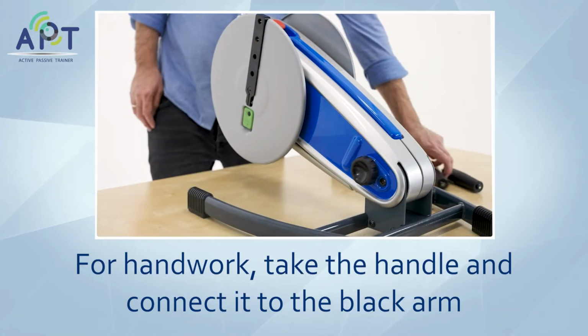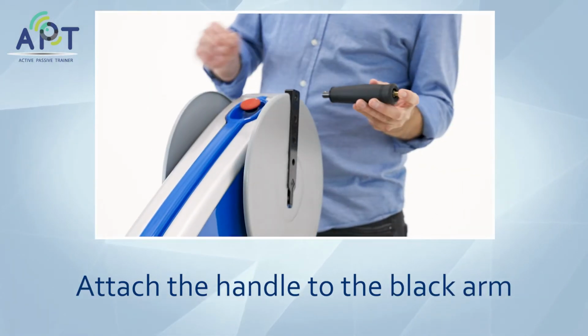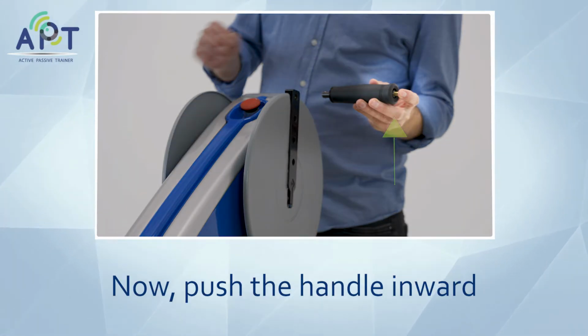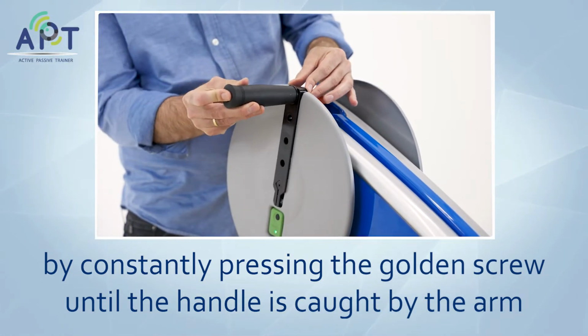For handwork, take the handle and connect it to the black arm on the side of the A.P.T. Attach the handle to the black arm while the golden screw is facing away from the A.P.T. Now push the handle inward by constantly pressing the golden screw until the handle is caught by the arm.